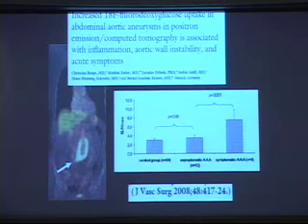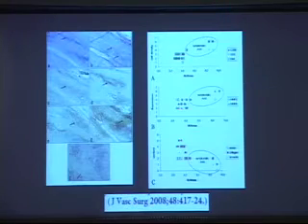Now going to a more recent paper that just came out by the group at Munich, August 2008, studying patients with AAA disease, but also having the chance to look at the pathology. Here, AAA inflammation, FDG, very high signal within the aorta, and a higher signal in symptomatic patients compared to asymptomatic and the control group. What's also exciting is that we had pathology here again.